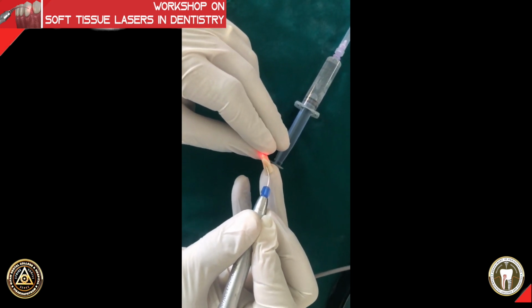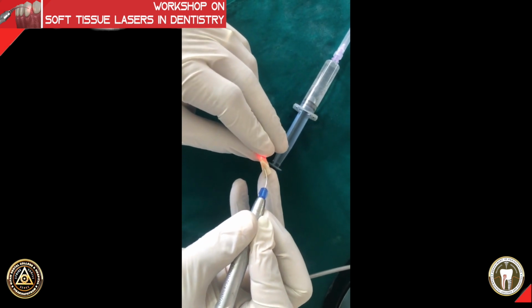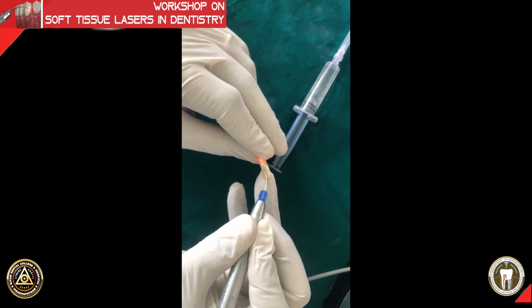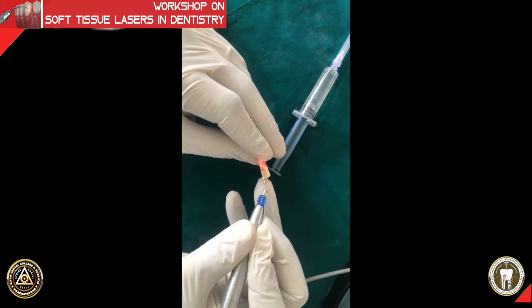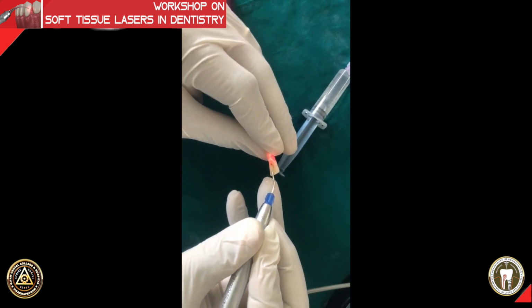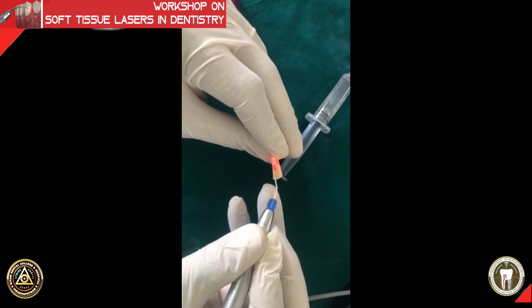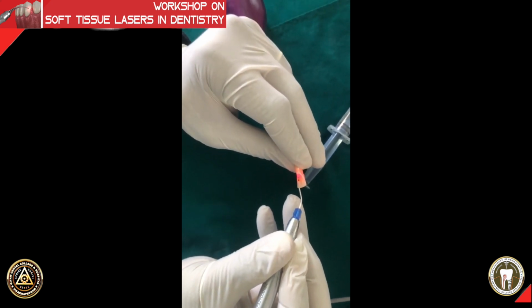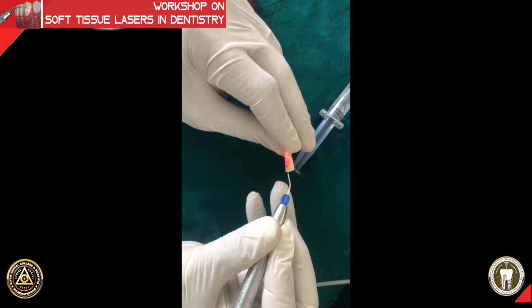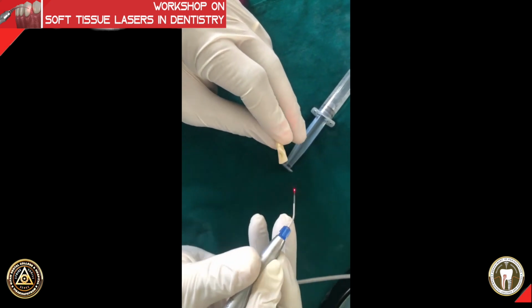Then you activate the laser and move the tip back in a circular motion, 1 millimeter every 2 seconds. That means for a 9 millimeter canal, it will take 18 seconds. You have to do that calculation every time you do a root canal disinfection. Once this has been done, you irrigate again with saline.